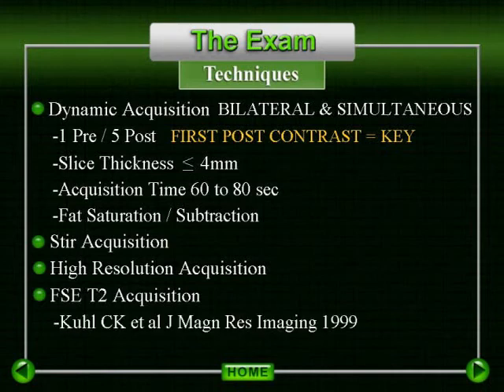In a 1999 article by Kuhl, the T2 signal characteristics were suggested to be of benefit in differential diagnosis with an elevated T2 signal correlating with benign disease. A 2006 AJR article by Bartella et al., however, noted that tumors could demonstrate hyperintense T2 signal in 24% of cases in their study. An additional 12% of malignancies demonstrated intermediate T2 signal. These latter findings are more in line with the findings we have noted in our practice.